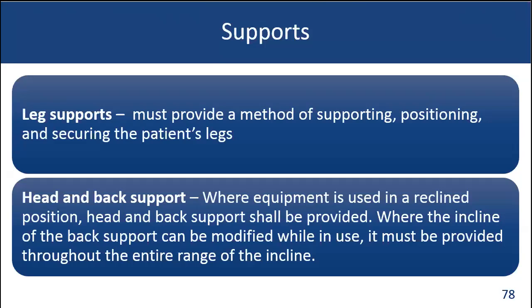Additionally, we've addressed head and back support where equipment is used in a reclined position. Now, head or back support must be provided for the entire range. What we're really saying is we don't want anyone to have to transfer off the equipment and then back on again after you adjust it. Once the patient transfers on the equipment, they should be able to stay on it while the head and back support needs to be adjusted.